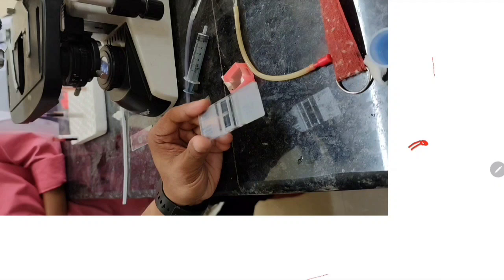First discard a few drops of fluid, because the stem part only carries fluid and no cells. After dilution everything is done, and after discarding a few drops, make a small drop at the tip of the pipette and put the pipette in between, here.